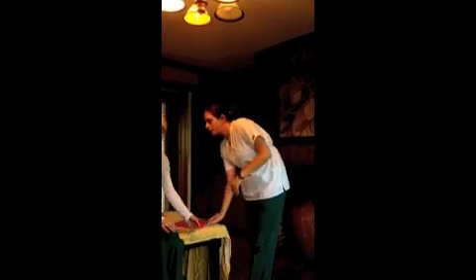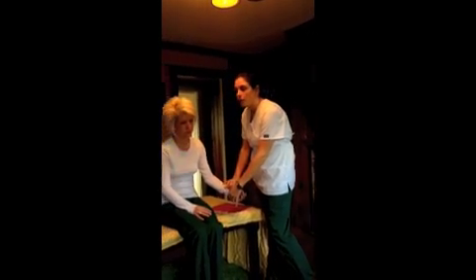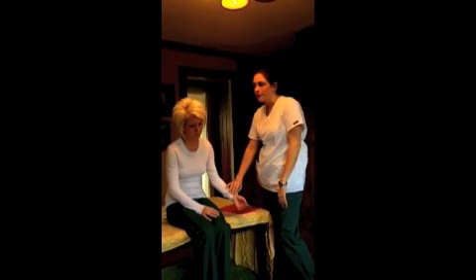I'm going to start your physical today with some vitals. Okay. I'm going to take your blood pressure and your pulse, and I'm going to check your respirations. While I'm checking her pulse, I'm going to watch the rise and fall of her chest to check her respirations as well. Her pulse falls within the normal limit of 60 to 100.